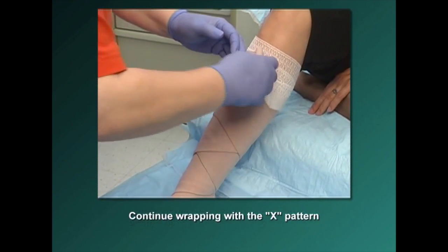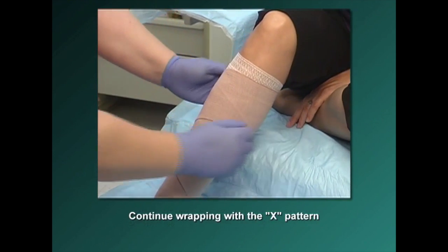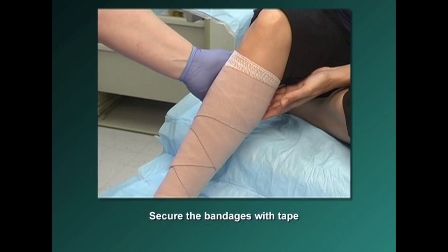Continue the diagonal pattern up and around, down and around, until you have wrapped the entire length of the leg. Use as many 4-inch elastic bandages as needed to wrap the lower leg, then transition to a 6-inch elastic bandage for the upper leg, depending on the size of the leg. Secure the bandages with tape.